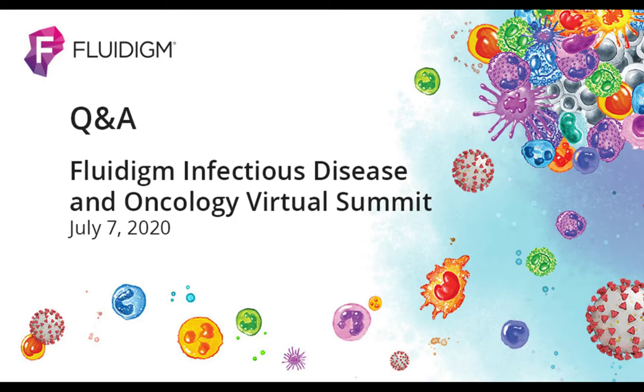I should note that we, as part of the protocol, actually do 4 assay replicates for each sample. Our microfluidic chip affords that, so when we run 192 samples, as you just heard Shelley say, each sample is actually processed in quadruplicate. And we use that information to really assist in the reduction of any types of false positives and false negatives.